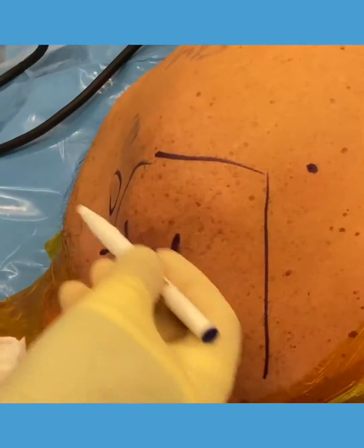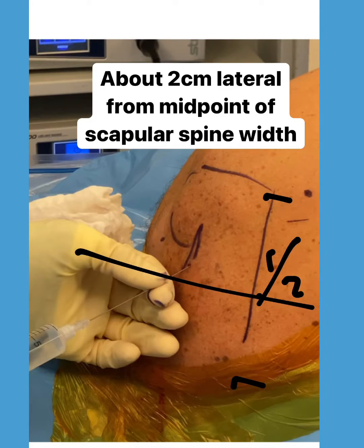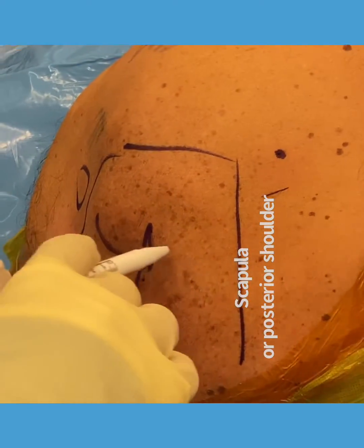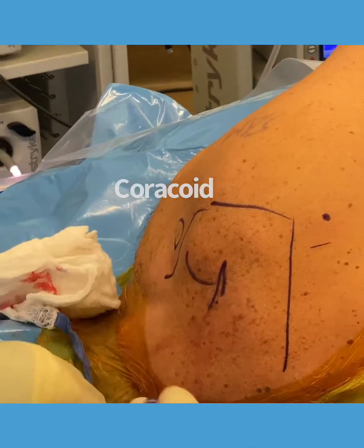And then what I do is I estimate where the glenohumeral joint is. The glenohumeral joint is going to be pretty much about this level, which means the glenoid is about this level here. You can use the coracoid as a landmark.